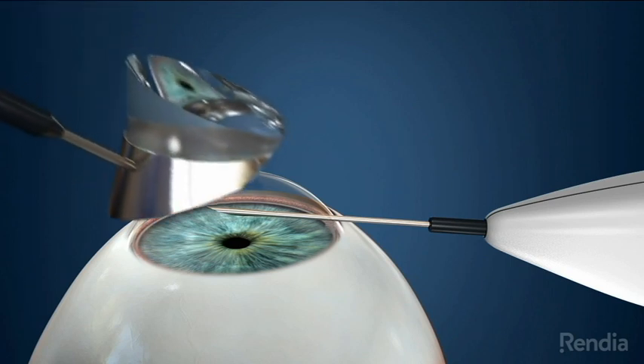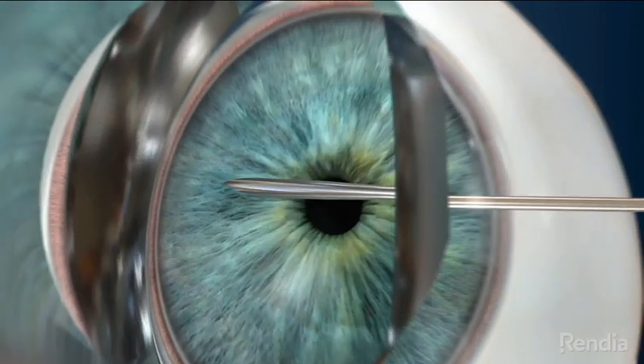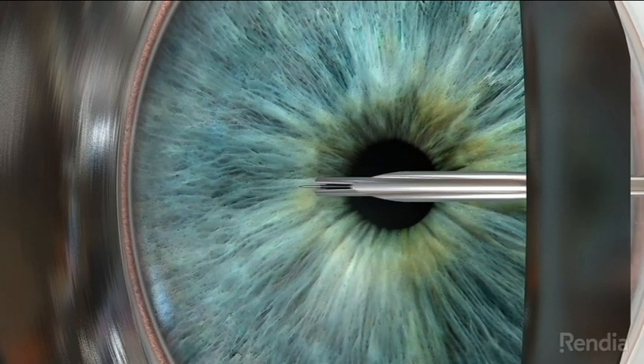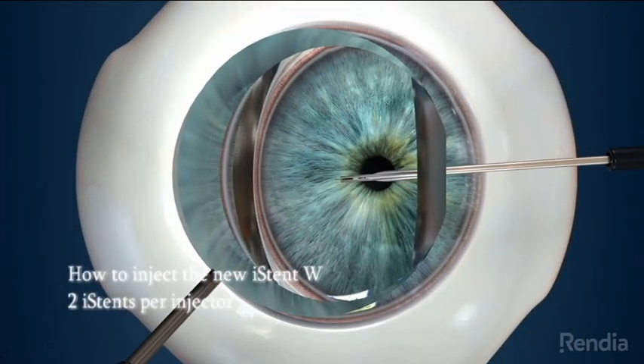Good candidates are patients with mild to moderate primary open-angle glaucoma, intolerance to treatment, or mid-20s IOPs that have a cataract. This cataract has been performed.